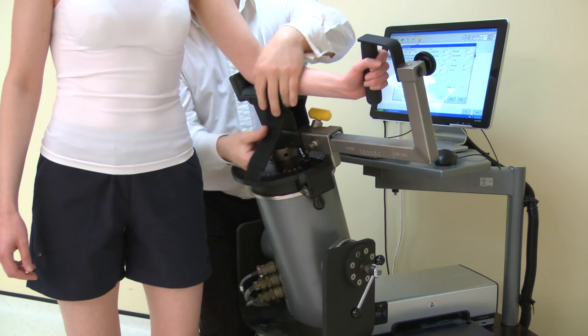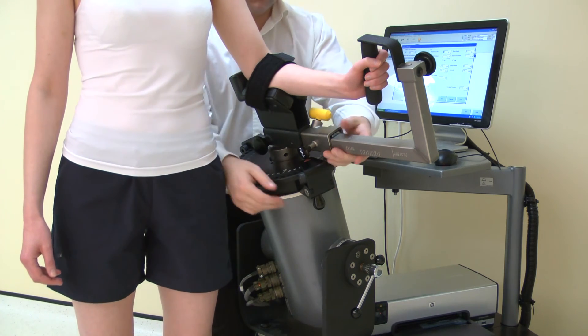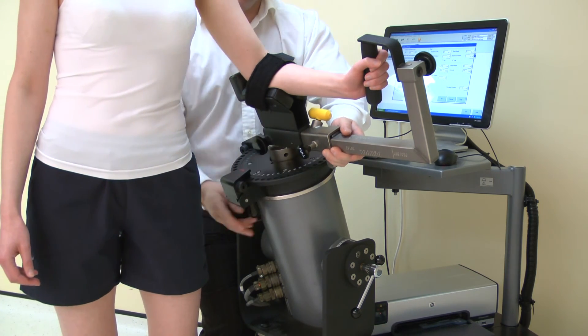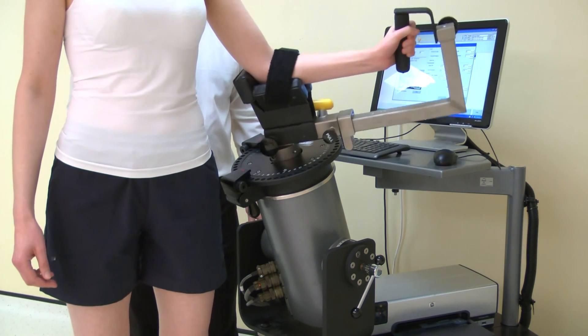Before beginning the test, secure the forearm strap to hold the elbow into the stabilizer. Now check the axis of rotation.